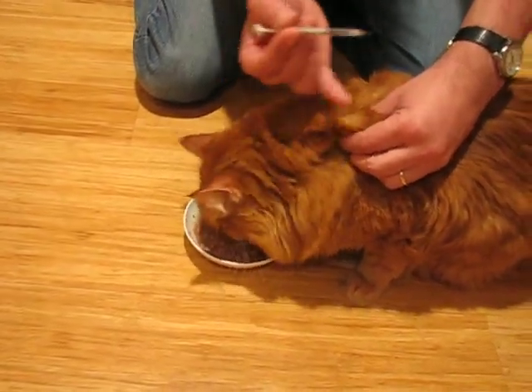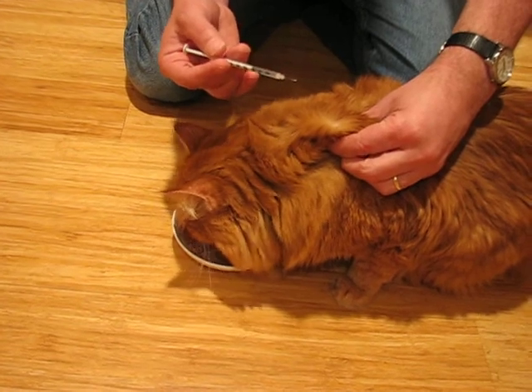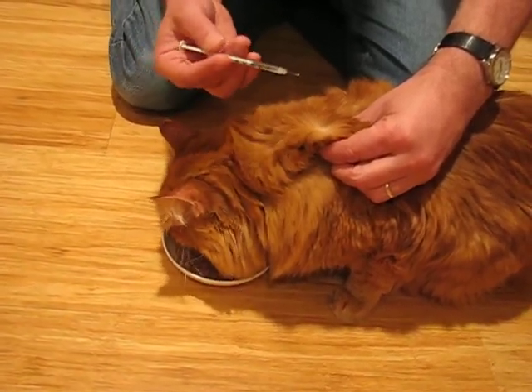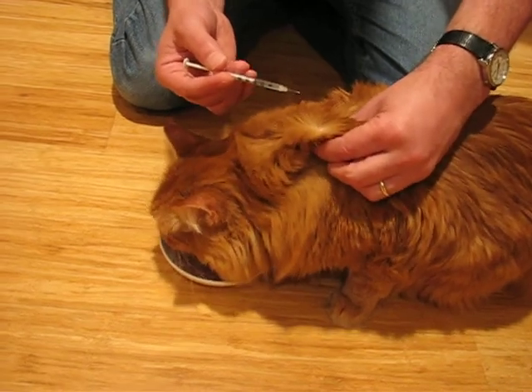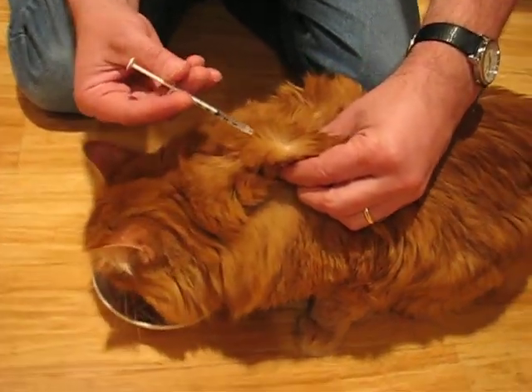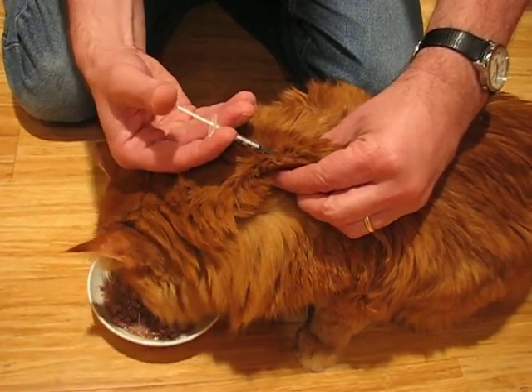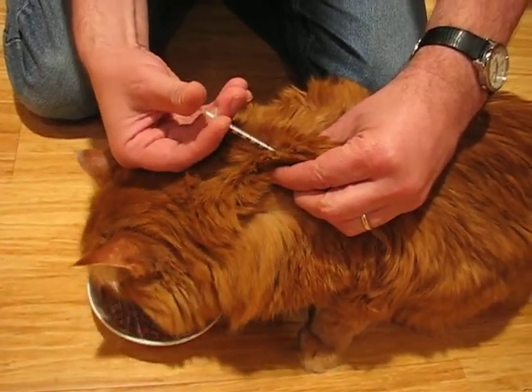A great technique for shooting your cat is to let their face get buried into their food. Lift up a nice, good-sized skin fold. If you have trouble seeing, sometimes we do, you can blow on it to separate the hair. You can hold up the hair.